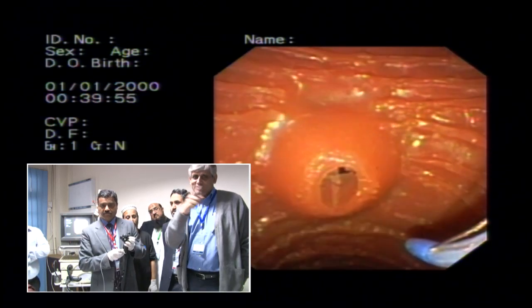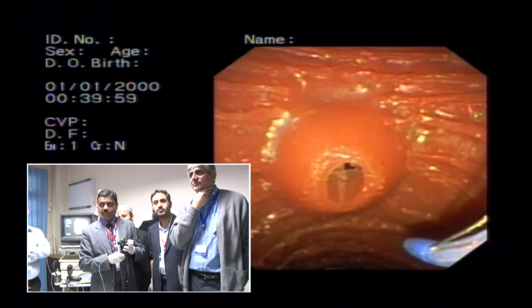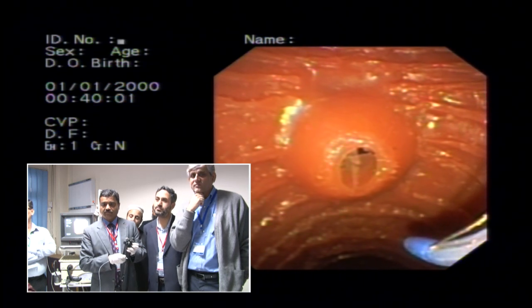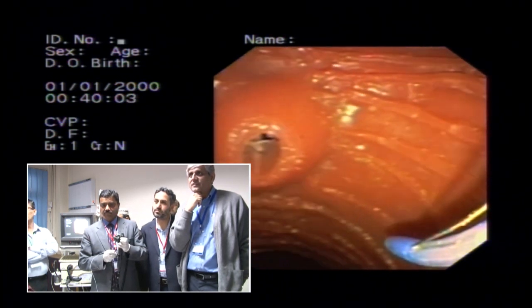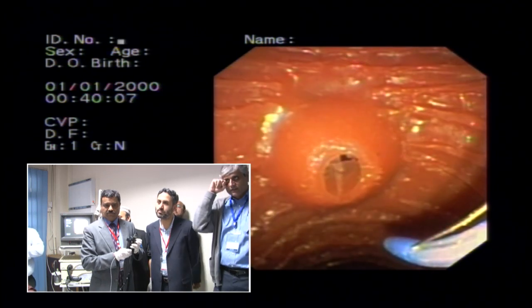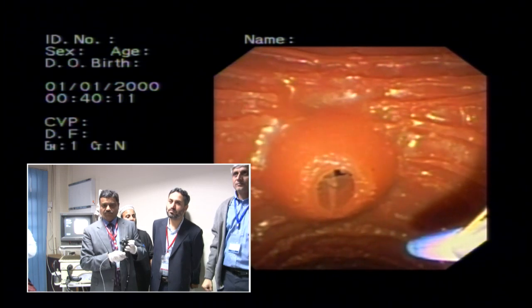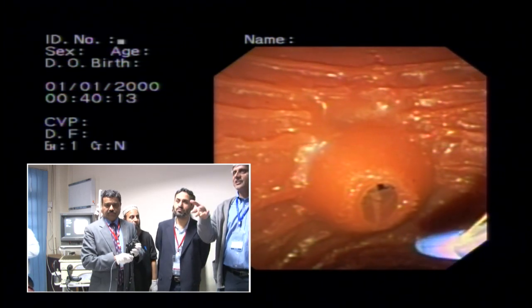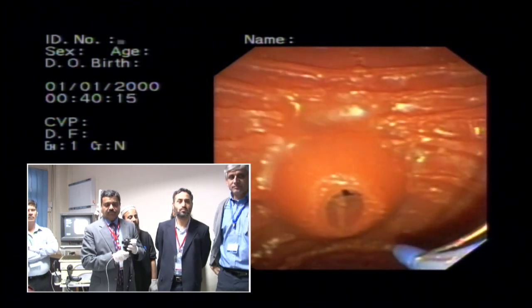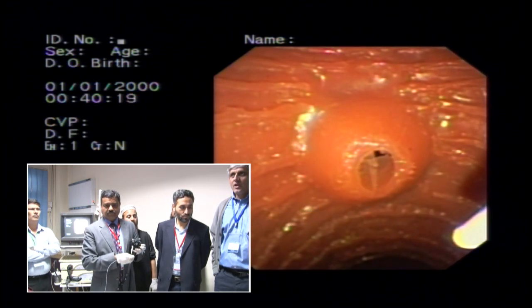Again, we'll have a difference of opinion. I do a lot more sphincterotomies than. What would be useful is, as when we start the actual work on the live patient, if Khalid can represent his talk, which will be on his presentation, I think that will stress the importance of this. Those are with us, so we can arrange that. Yes, yes, just to press a point home.